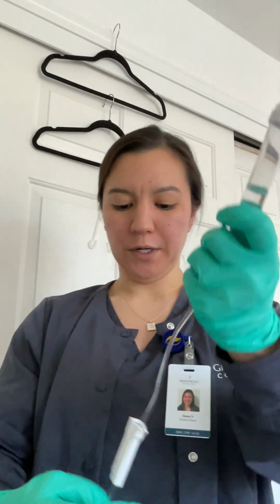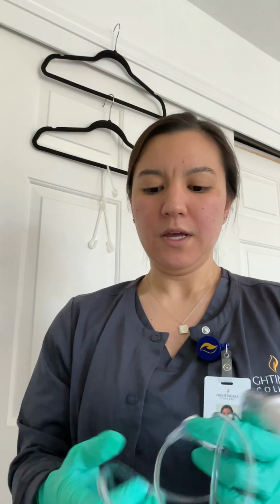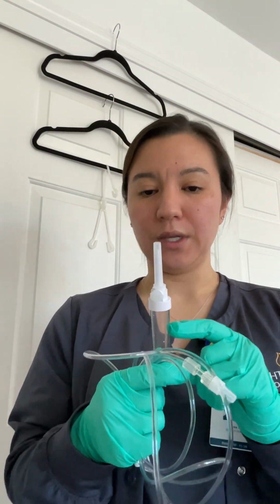All right, so I'm going to go over the IV tubing first. We're going to start with the main IV tubing. This one is going to be the spike end. This one remains sterile. Do not open this until you are ready to spike your bag. This is where the fluid is going to go through into the drip chamber. You are going to make sure that the drip chamber is halfway full with the fluid that you are putting into the patient, leaving enough room to be able to see the drops going in.